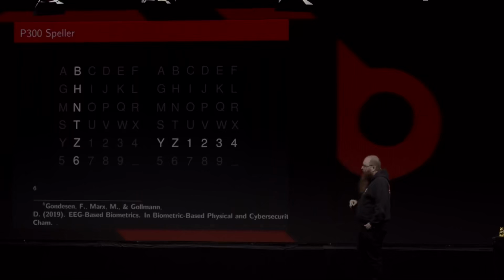We did cross-validation on the data here, where we have the best score. We also did train the classifier, which was a simple linear discriminant analysis. We trained it just by the experiment done by one person, and then we also tried to do a general classifier that we trained with other people's data.